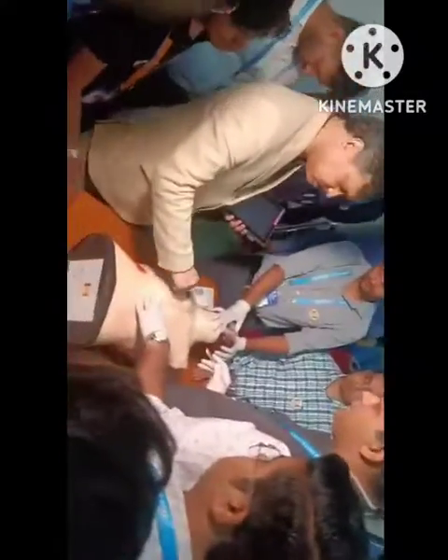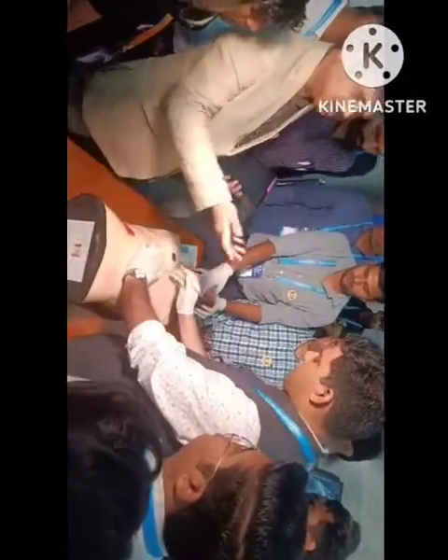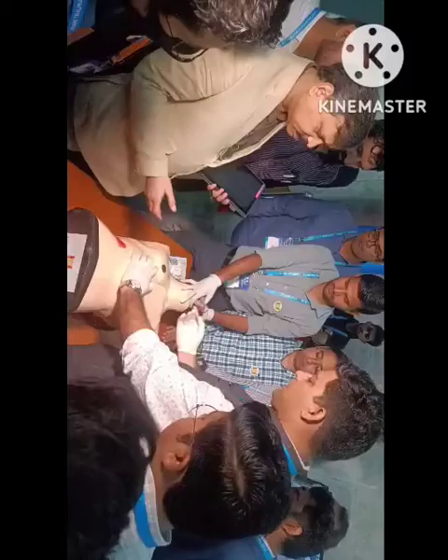It will be from here because if we need to do a clamshell, we can immediately extend that. I am saying let's start the skin incision on the right side of the chest, and we will go deeper on the left side. Just the skin incision, so that we have a marker.